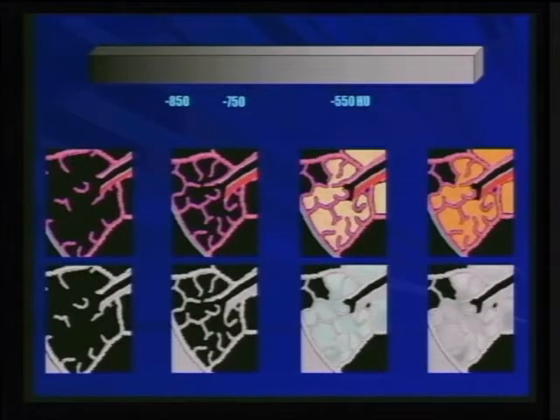And then we're talking, a good example would be pulmonary emphysema, and we're going to see some examples of that. And then as you go to thickening of the interlobular septa, you may see this framework of thickening of the outline of the secondary pulmonary lobule, but also intralobular septa. And then you have increased opacity, in contrast with interstitial lung disease, you see this increased opacity within the confine of the secondary pulmonary lobule and the acini.